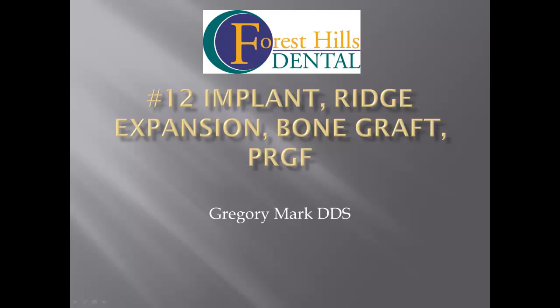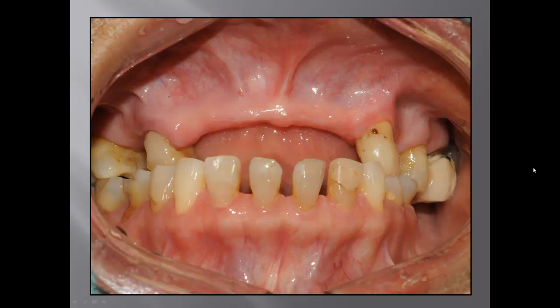Hi everyone, my name is Gregory. Today I would like to share with you one of the techniques I've been using in my office, step by step. This lady is in her mid-60s and has been wearing her upper partial denture for more than 30 years. She says she doesn't like her appearance and would like something done to improve her cosmetic outcome.